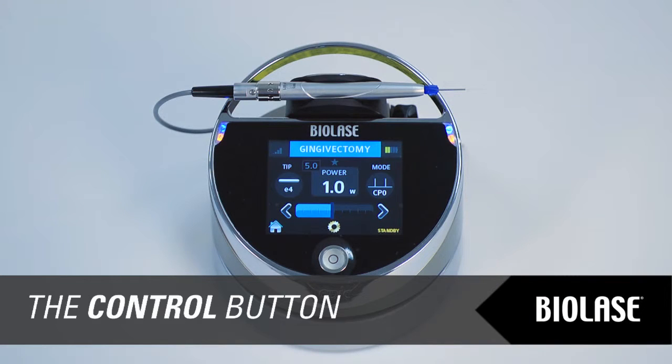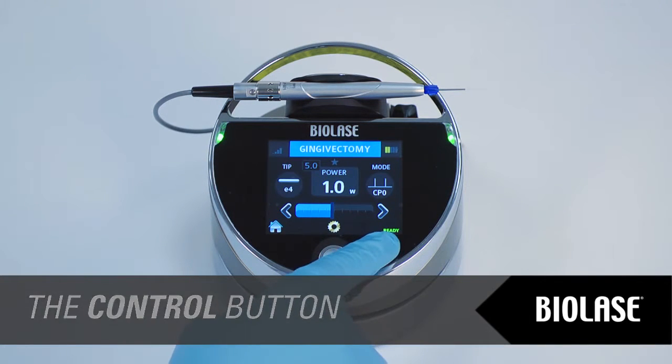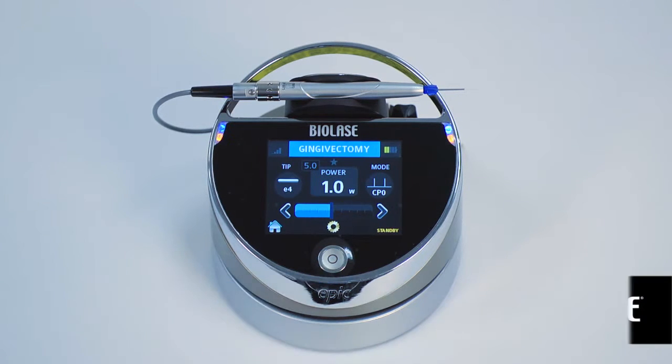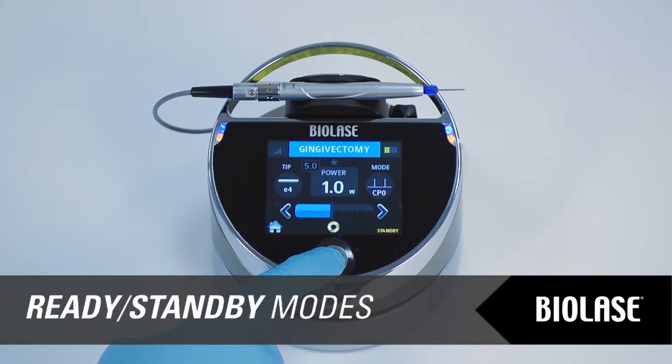The Control button on the EPIC is a multifunction button. Pressing and holding the Control button for 2 seconds will allow you to transition the laser from standby mode to ready mode. Note that you will not be able to place the EPIC in ready mode unless you have selected a treatment mode on the home screen first. Press and release the Control button to place the EPIC laser into either ready or standby mode.